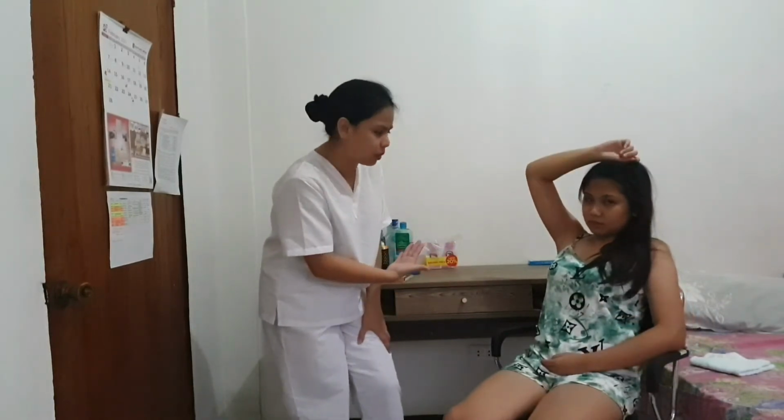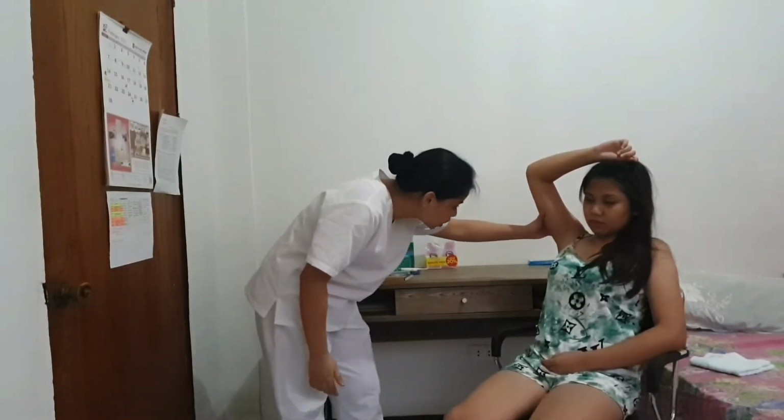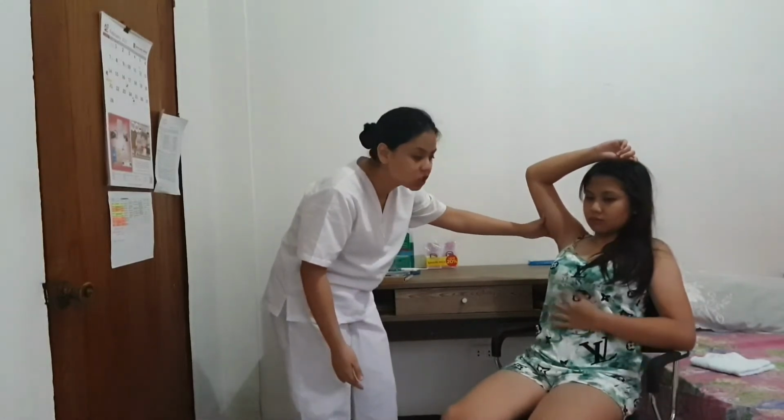Before I do anything, I will inspect if her underarm has skin lesions or perspiration. From my observation, she doesn't have skin lesions, but she has perspiration.